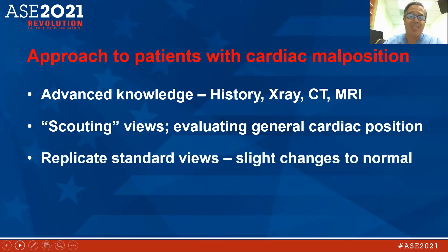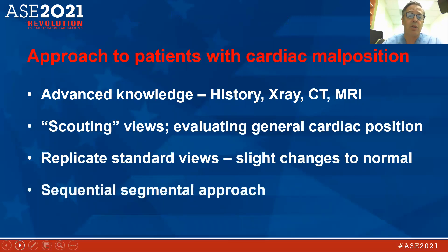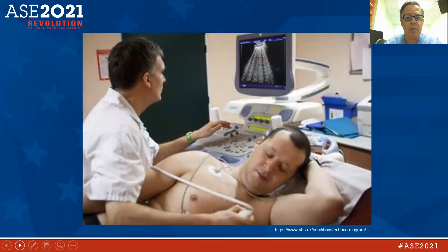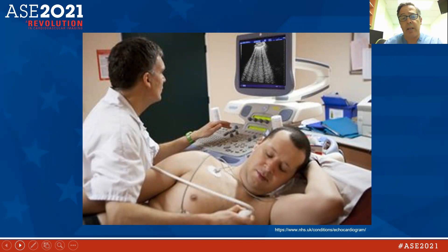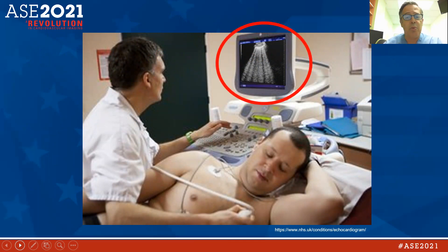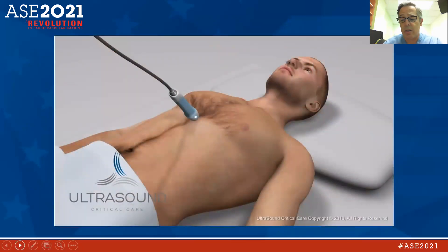You want to replicate standard views with slight changes to normal, which I'll go over. We also use the sequential segmental approach in pediatrics — it helps us put the heart together from its segments to understand the connections. If you're scanning from the left parasternal view and can't get much of an image, your next step should be to lay the patient down in the supine position and perform a subcostal scan.